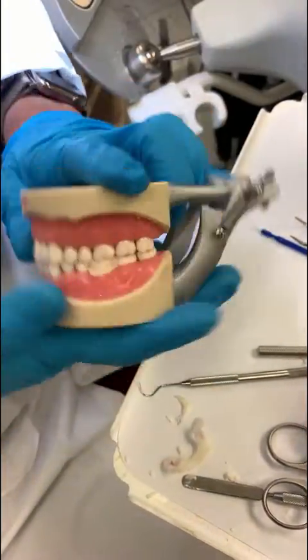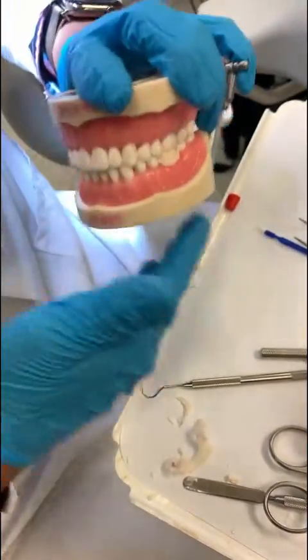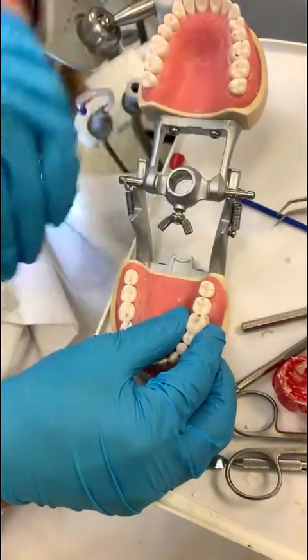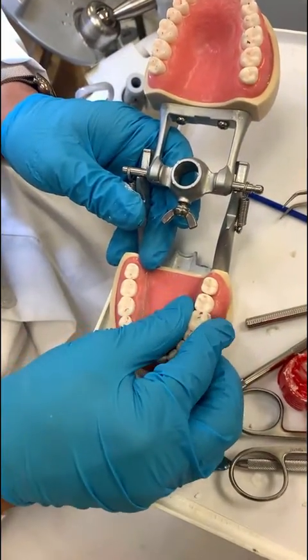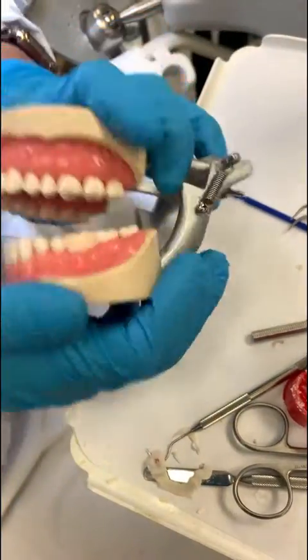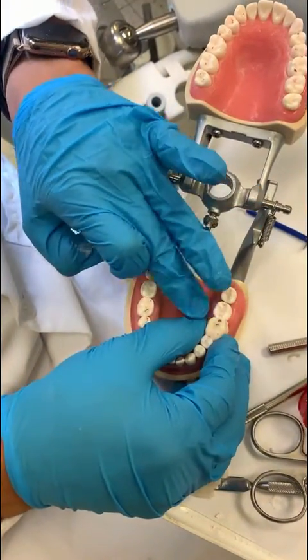I'm going to press and have them bite down. When you bite down, this margin is going to separate. What I'm going to do now is use two fingers — one buccal and one lingual — to keep it in place. At the same time I'm going to check the bite. That's what I normally do with real patients.